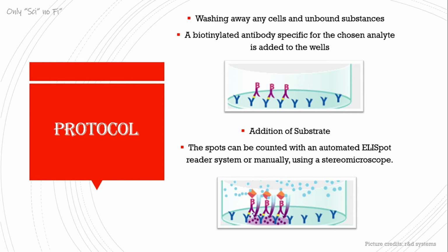So what happens is, wherever there were cells initially in the microtiter wells, cytokines were secreted which were attached to these antibodies, and then secondary antibodies were used to check these cytokines. The presence of spots in the medium indicates that our particular cytokine producing cells were present, and therefore the enzyme converted the substrate into a colorful product which can be observed on this plate.